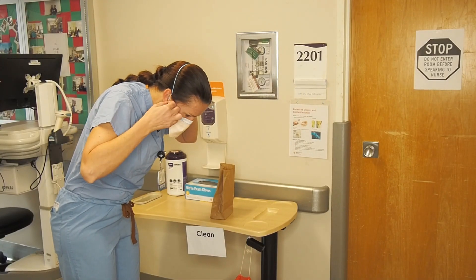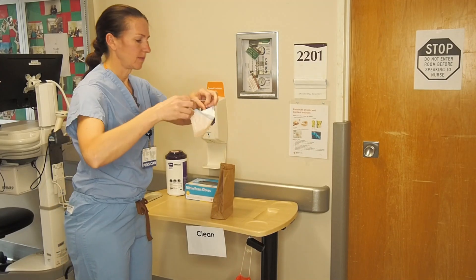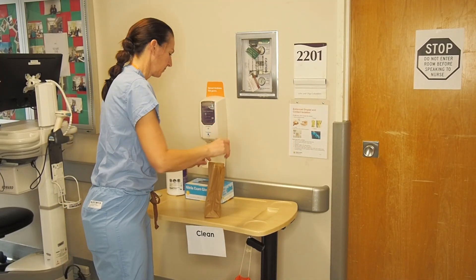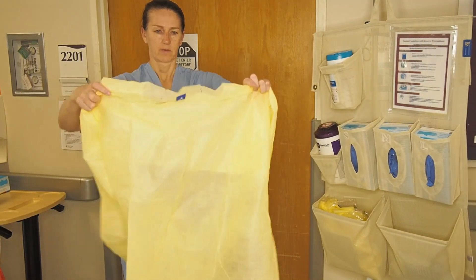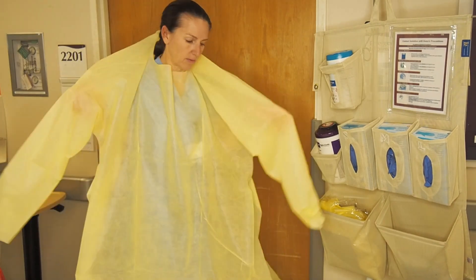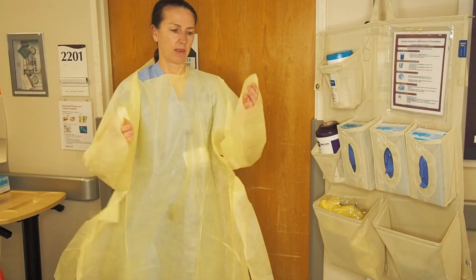Carefully remove your N95 respirator or surgical mask and place it back in the brown paper bag. It's time to gown up. Carefully inspect the gown on both sides for defects. Place your head through the hole, secure it behind your neck, and place your hands through ensuring your thumbs go through the holes.